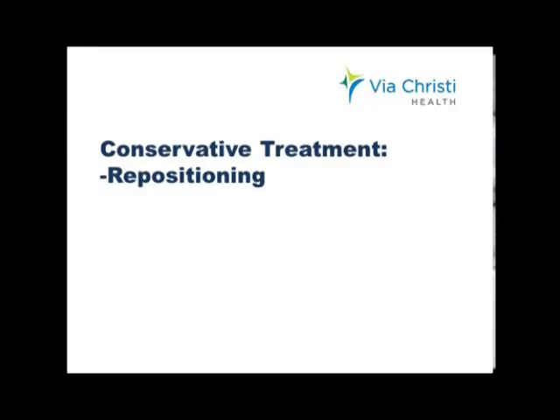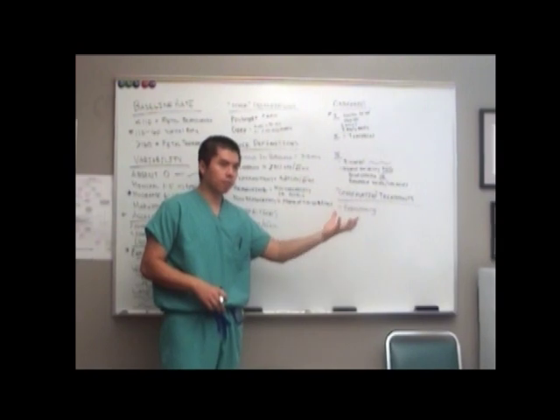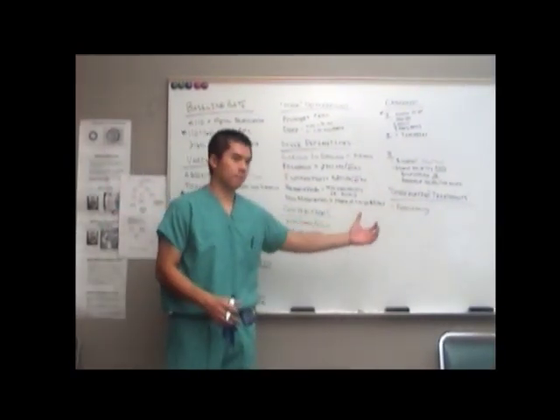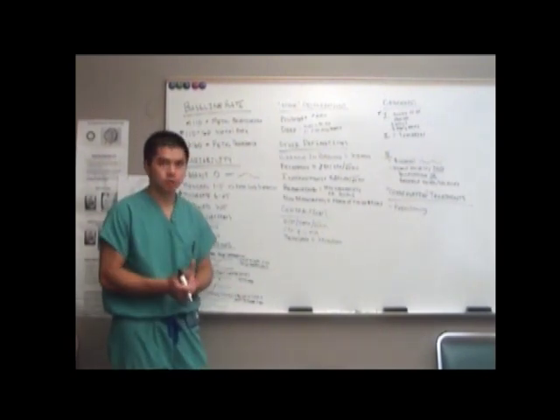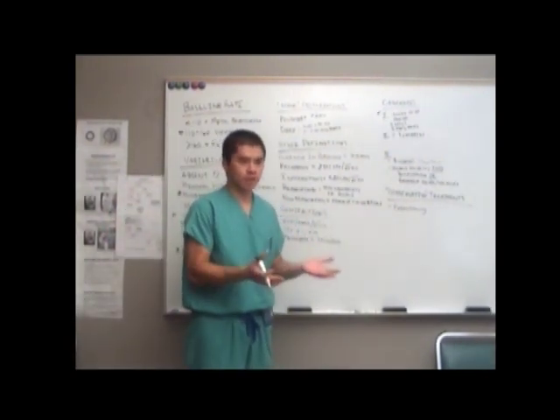So there's 4 things, 3 main ones and 1 depending on your patient. So the first one is repositioning. So with these treatments, I want you to think about how they work, and then what's causing your decelerations, and how they might be addressing the cause of your deceleration. So the first one being repositioning, what's happening in that case?